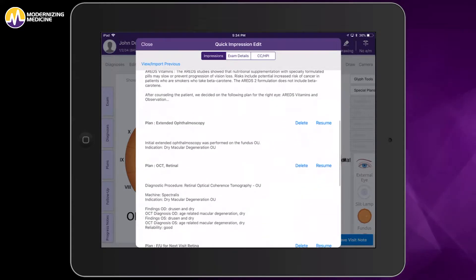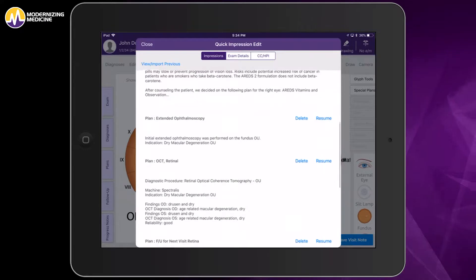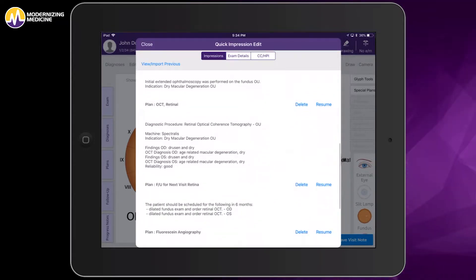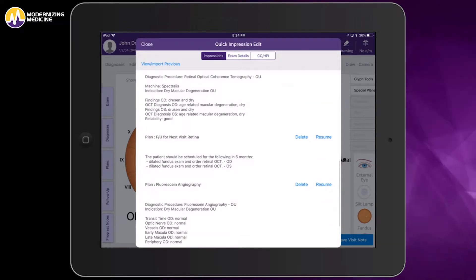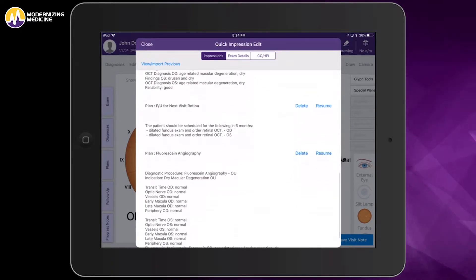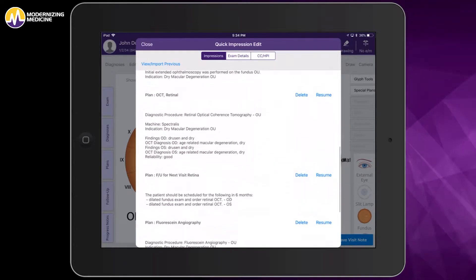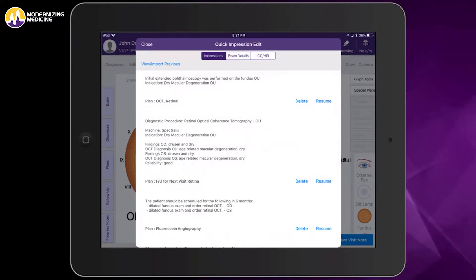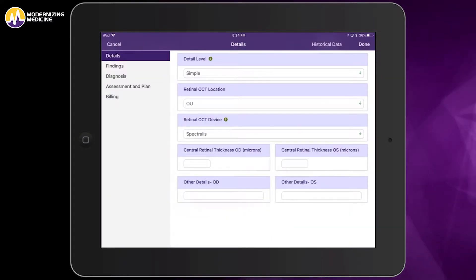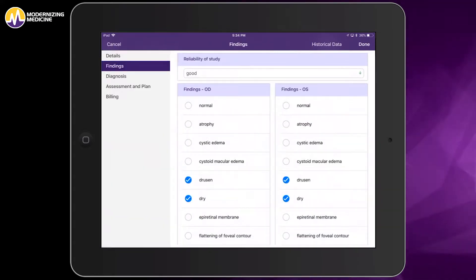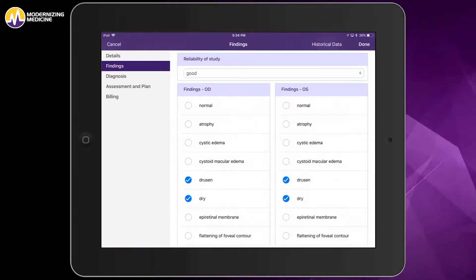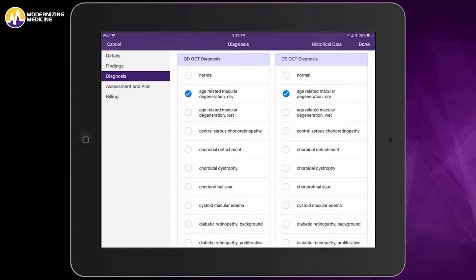Additionally, an extended ophthalmoscopy is pre-built, along with an OCT, and a follow-up for the next visit, and a fluorescein angiography with all the interpretations already complete. I can also change any of these pre-done interpretations. If I touch resume, I can add the central retinal thickness to the OCT and change the findings that have already been pre-populated in my protocol.